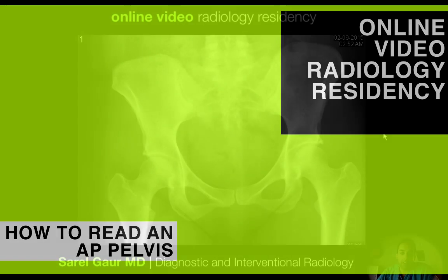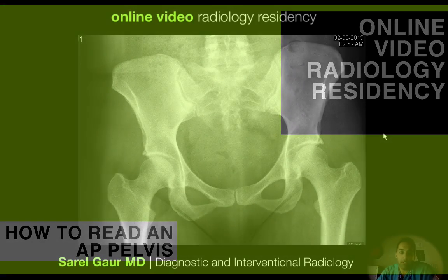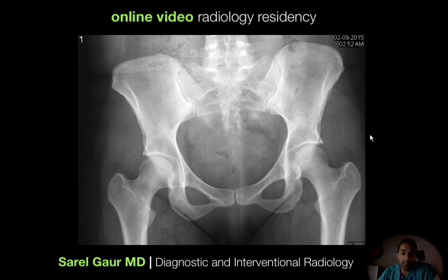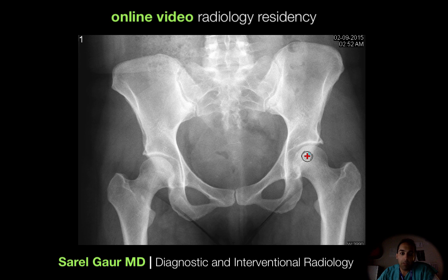Today we're going to be talking about how to look at an AP pelvis in the trauma setting. Here I have a plain film of the pelvis — this is an AP of the pelvis — and I'll go through it step-by-step on how to look at this and exclude fractures.